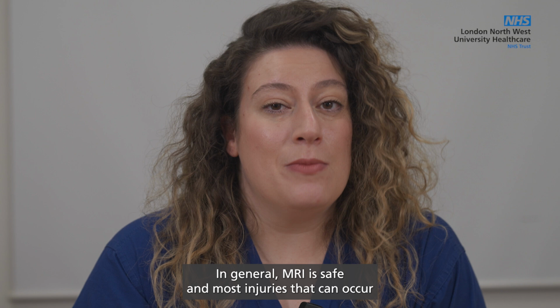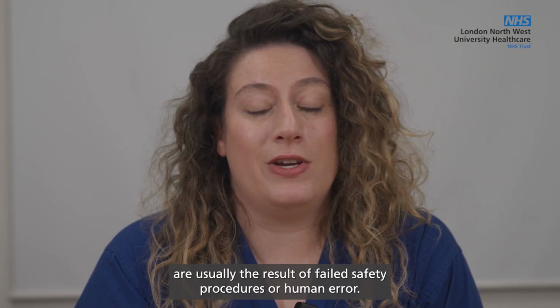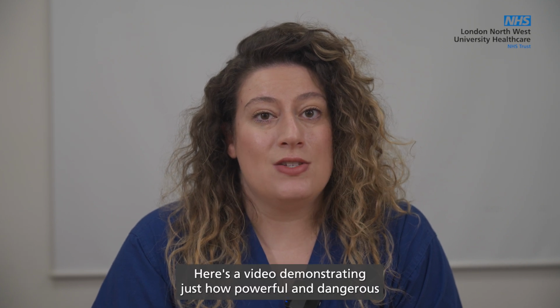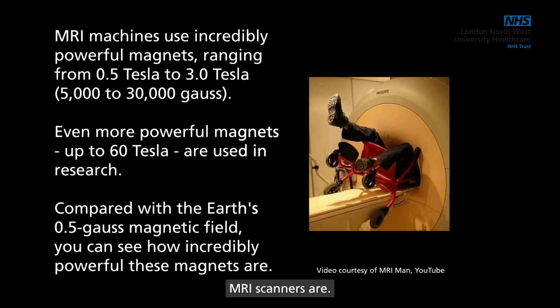In general, MRI is safe, and most injuries that can occur are usually the result of failed safety procedures or human error. If you're in doubt at any point, please ask your MRI radiographer. Preparation and knowing your patient's history are key. Here's a video demonstrating just how powerful and dangerous MRI scanners are.